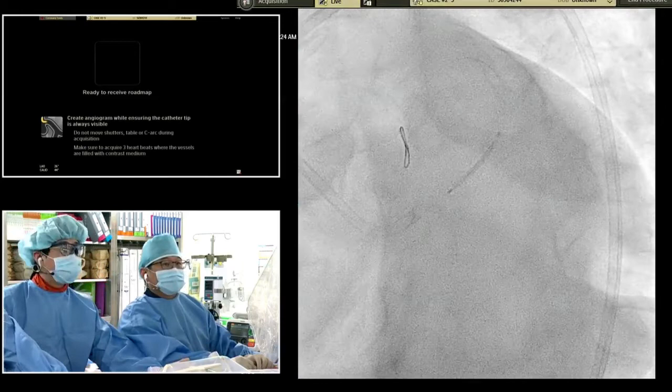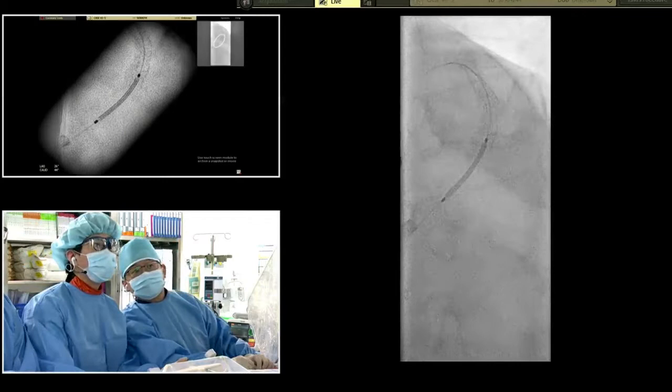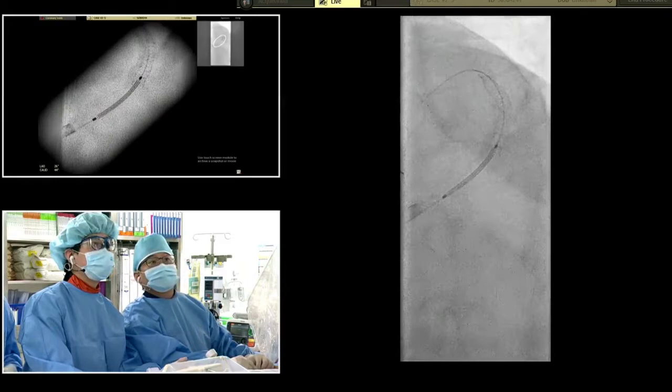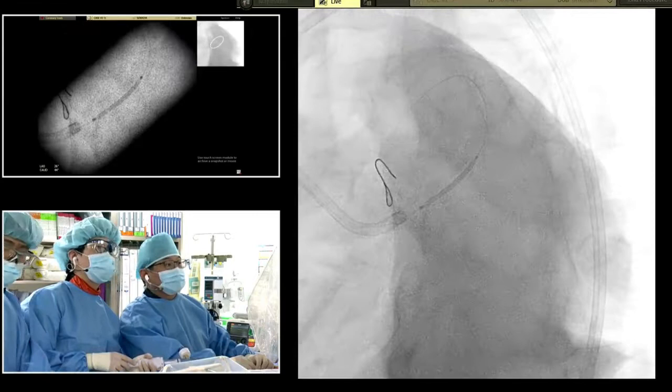Yeah, prepare better. I think he did some high-pressure dilatation on the left main, did he not? Yeah, but I think we need more. The calcium is very, very thick, so in my opinion I need more lesion preparation before I put a stent there. I think the question is also that they have somewhat limited tools, not to be pejorative in any way, but it's a big vessel, so I think the options are to cut it. You don't have some of the other options we might have elsewhere in the world.